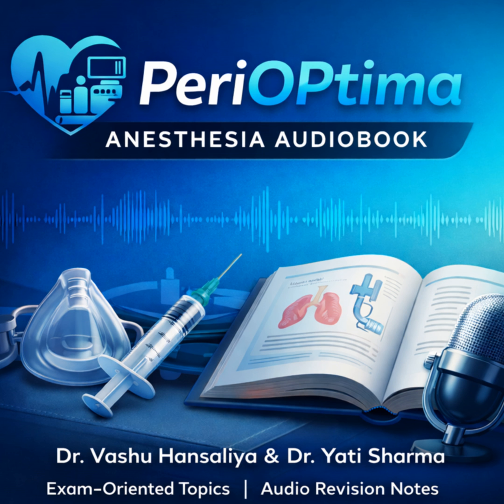Straight from the sources, the definition you give is: mechanical ventilation is a means to support or replace the patient's breathing function. But you have to immediately follow that up. With what? With the single most important concept in critical care: it does not cure disease. Ah, that's the key distinction. It's a bridge. It's not the destination. Exactly. It buys time. That's all it does. It allows the body to recover, or for the antibiotics to finally kick in, or for a tired heart to rest, all while we maintain gas exchange. It is supportive, never curative.